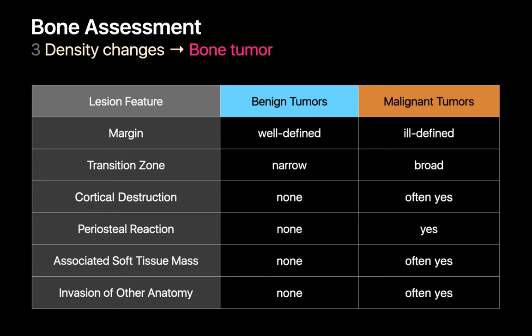After you check for unusual changes in bone density, check the medullary texture of the bone and its fine trabecular pattern. Sometimes a focal disruption of the fine trabecular pattern might help you catch a subtle fracture you might have otherwise missed. Other times, focal absence of the fine trabecular pattern may help you catch a subtle localized bone lesion.